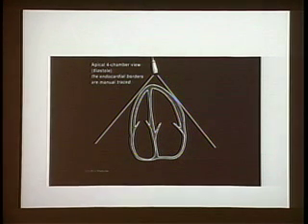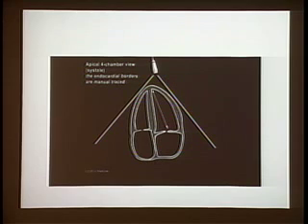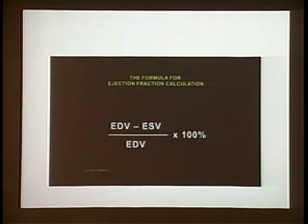So you trace your endocardium, and each machine has different software to do this. They vary a little bit. If you want, this afternoon we might be able to play a little bit with this. So you do this in diastole. You do this in systole, and then you get diastolic volume minus systolic volume over diastolic volume. This gives you an EF. Okay? And it's better. And theoretically, you should be able to then get the EF in a 4-chamber view, get an EF in a 2-chamber view, and basically average those two. If you do that, at least you're taking into account different walls.